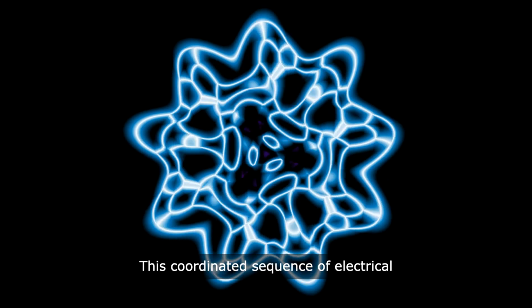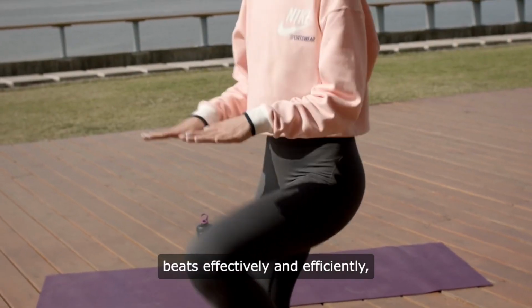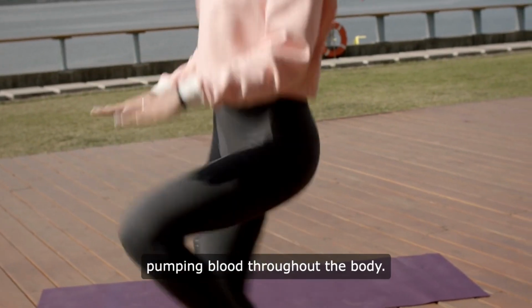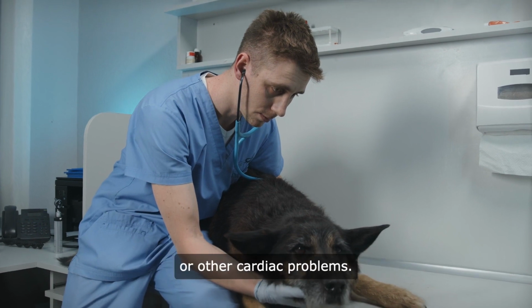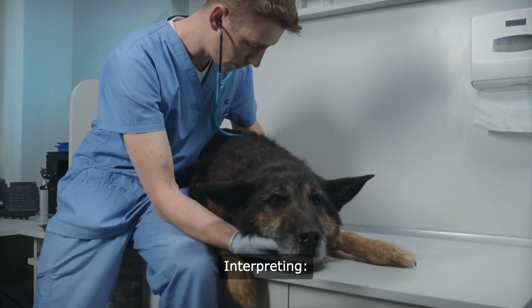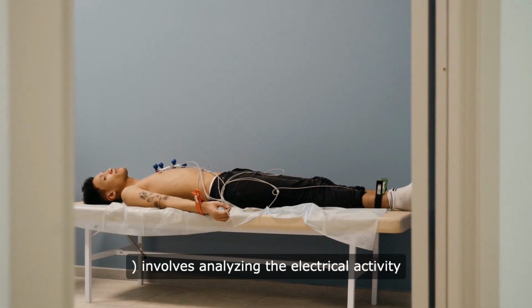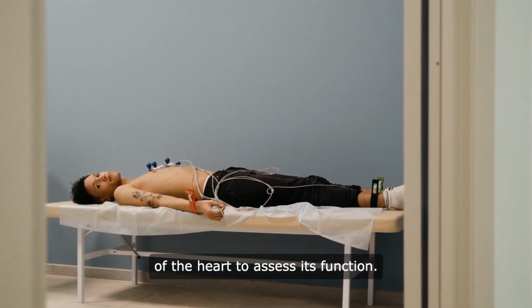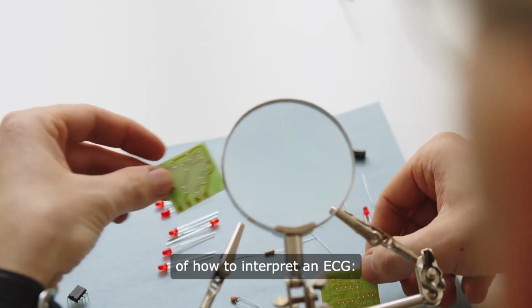This coordinated sequence of electrical impulses ensures that the heart beats effectively and efficiently, pumping blood throughout the body. Dysfunction in any part of the heart's electrical system can lead to arrhythmias or other cardiac problems. Interpreting an electrocardiogram, ECG, involves analyzing the electrical activity of the heart to assess its function. Here's a brief overview of how to interpret an ECG.